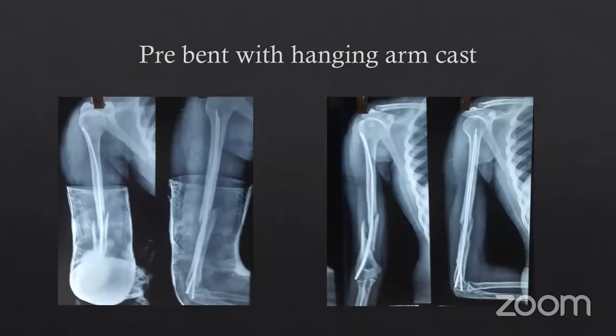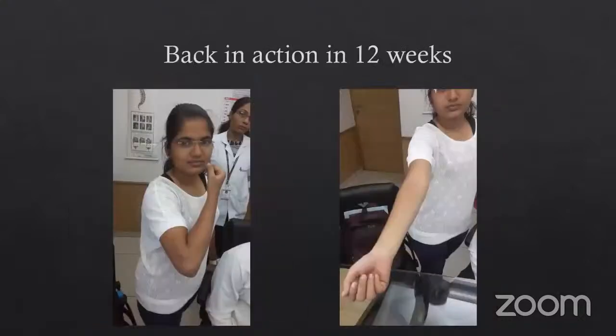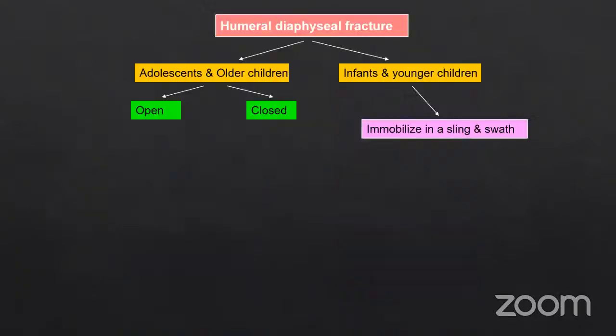So again, what we did was a couple of nails pre-bent in excessive valgus to counter the forces of varus, and a small hanging arm cast, with a small percutaneous incision. That is how she healed in about 3 months' time. And that is her result. She's back in action in about 12 weeks with full function of her elbow and shoulder, and she's back to her judo. So you can use these elastic nails in the adolescent age group.